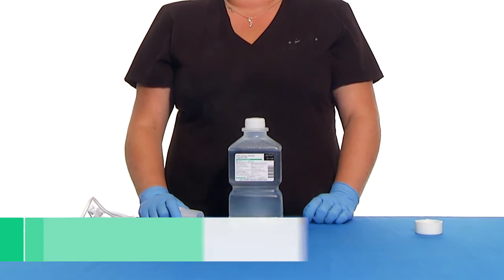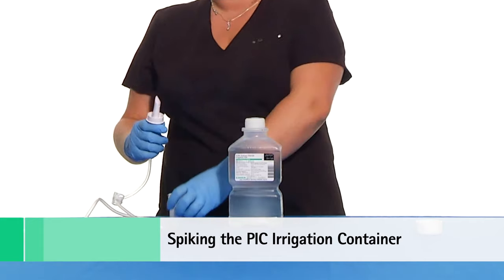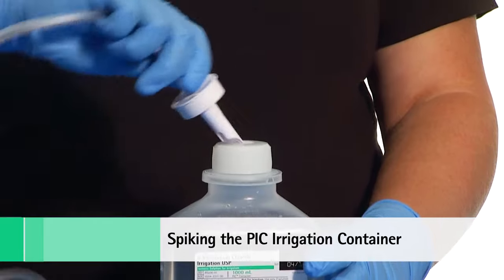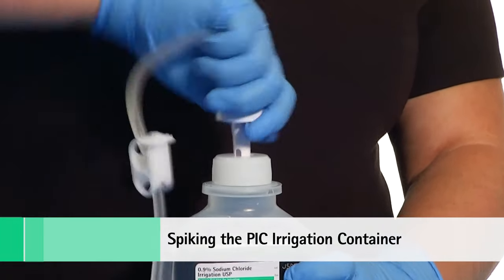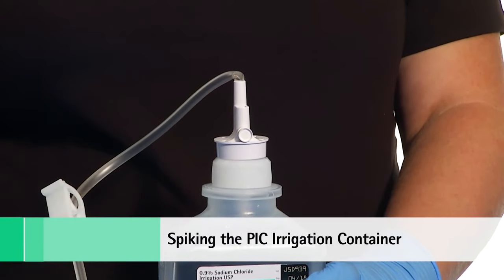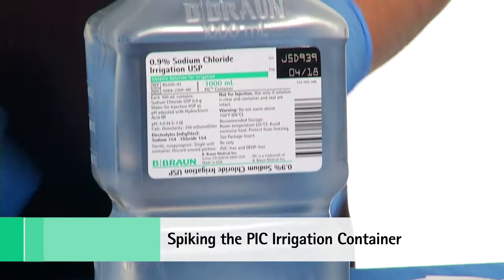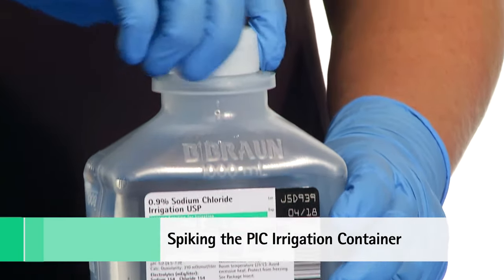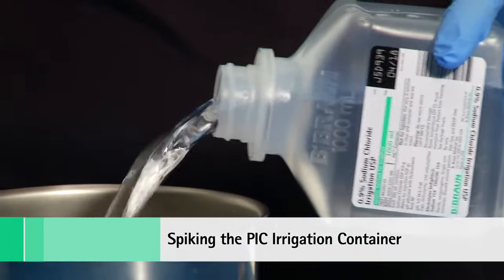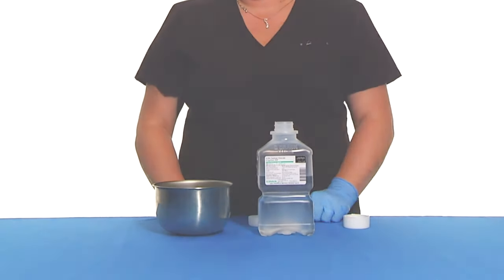To spike the PIC irrigation container, connect the unispike irrigation tubing by placing the container on a flat surface and twisting and pushing the spike straight through the internal screw cap, past initial resistance, to a point where the spike shoulder is flush against the cap. To use as pourable irrigation, simply remove the internal screw cap and pour. The PIC irrigation container provides a no-drip lip to minimize the potential of fluid and environmental contamination during pouring procedures.